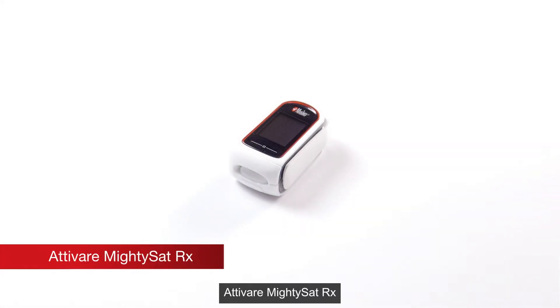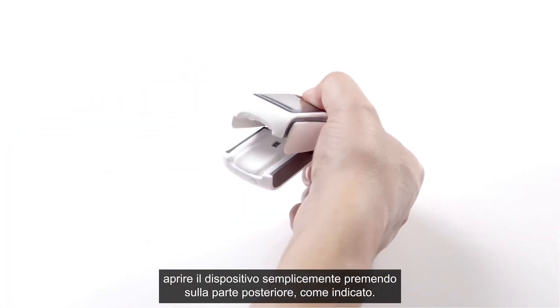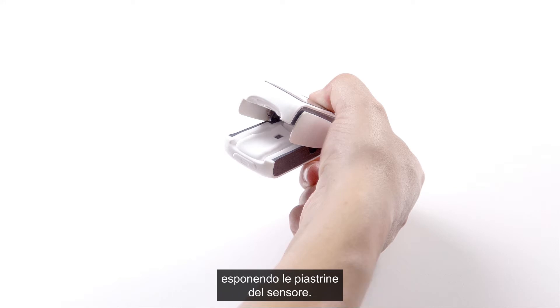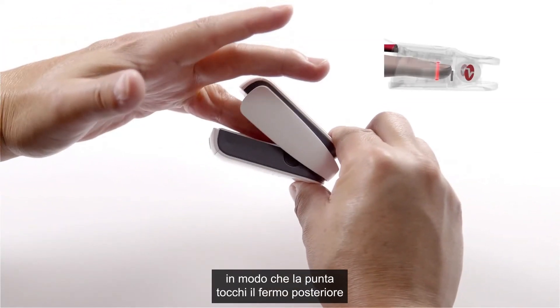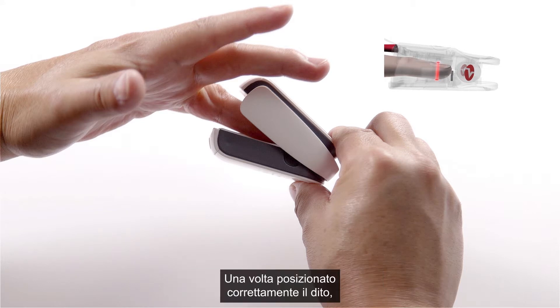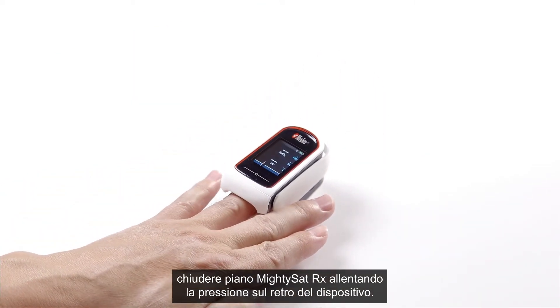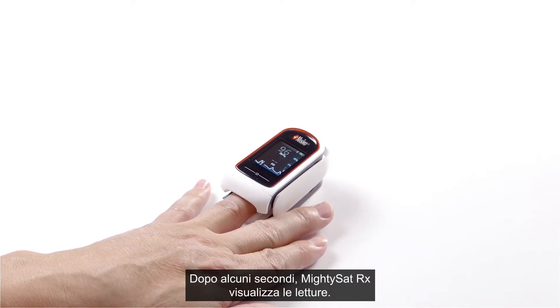To activate MightySat RX and take readings, open the device by squeezing the back portion. MightySat RX will automatically activate when the device is open so that the sensor pads are exposed. Position the finger so that the tip touches the backstop at the end of the sensor pad, ensuring correct positioning for accurate measurements. Gently close the MightySat RX by releasing pressure on the back. After a few seconds, MightySat RX will display readings.